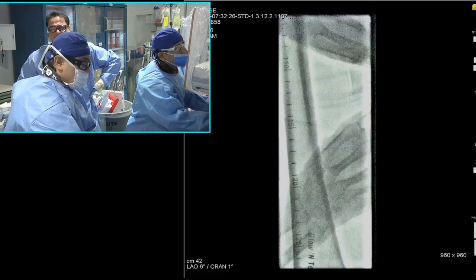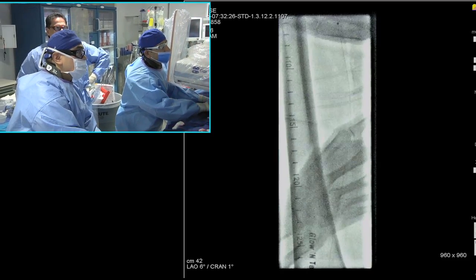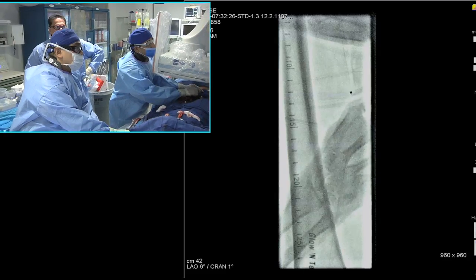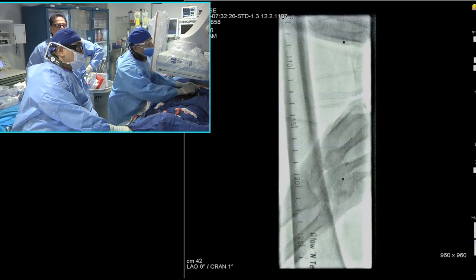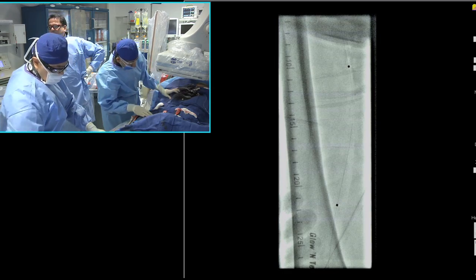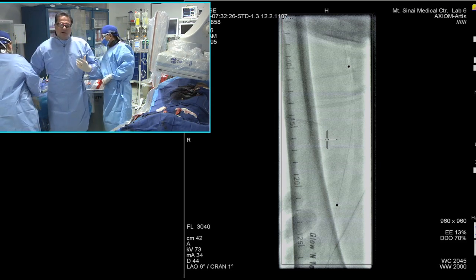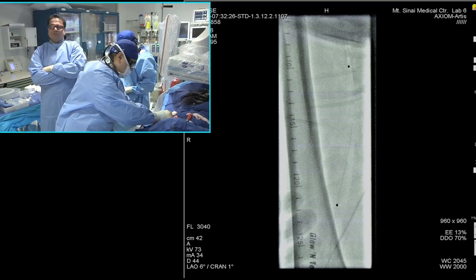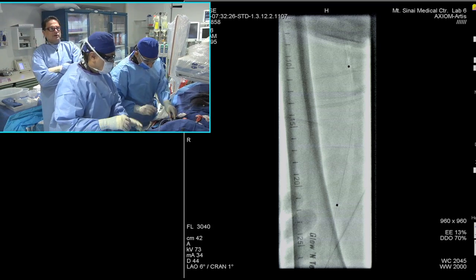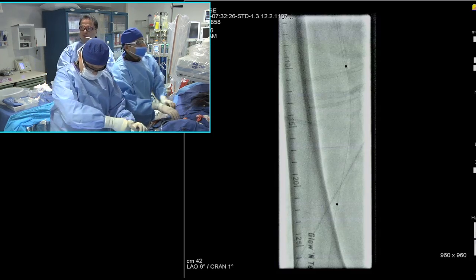So I think that's a good point. I always get into this with people. It's very hard to compare trials, as we just spoke about. Endpoints are different. Meaning, what is a PSVR in the Lutonix trial is 2.5, and what is it in the Medtronic trial is 2.4. So the endpoint may be different. Number two is, in terms of blinding, there are issues with blinding. People say one trial was blinded over the other. I don't look at it that way. I look at it as in this particular category, drug-coated balloons work.